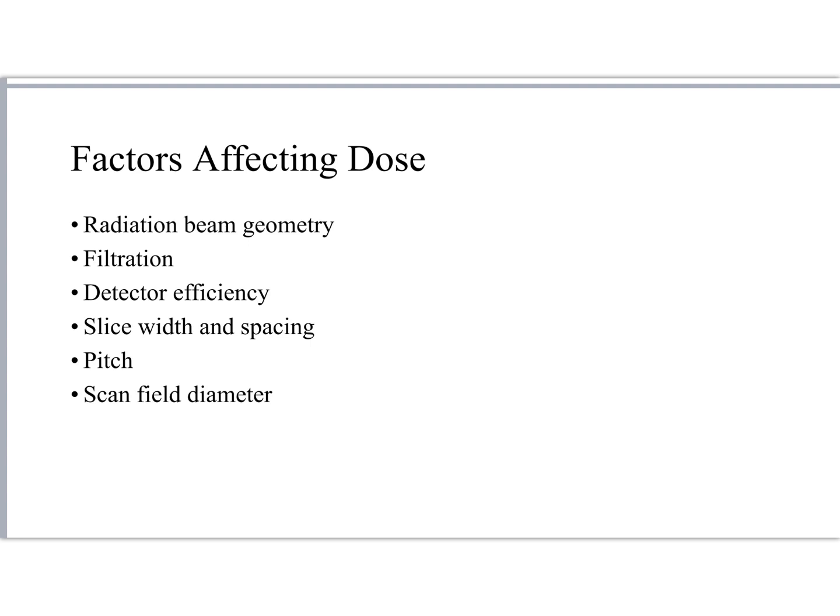And then also the scan field diameter. This is kind of related to collimation within radiography. So as we increase that scan field of view, we are increasing patient dose.